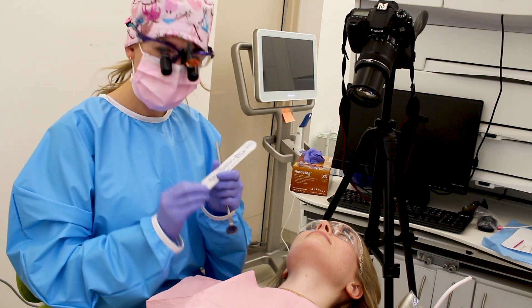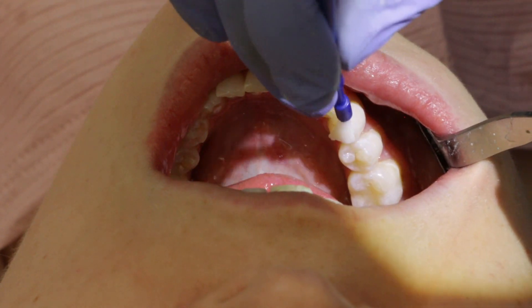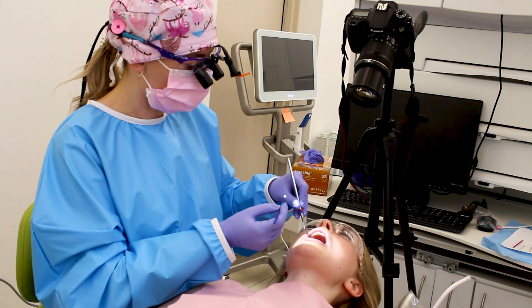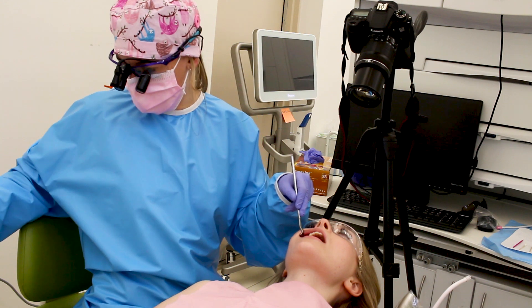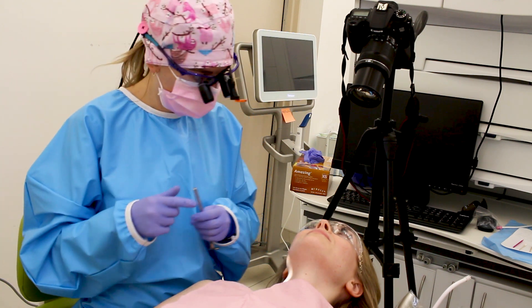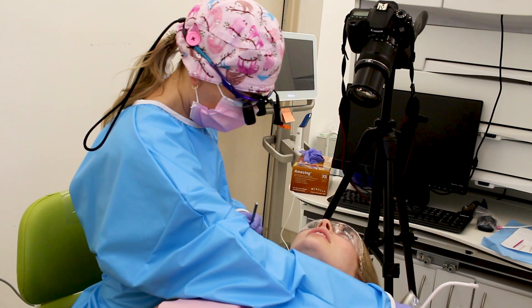We're going to open up the fluoride today and paint it on her teeth — it goes on almost like nail polish, you just paint it right onto the teeth, and because it's sticky it'll stick right where we want it. There's a whole controversy about fluoride and whether it's good for you, but for your teeth it helps to re-harden and re-strengthen the enamel, which prevents decay, cavities, acid erosion, and will just help to re-strengthen the teeth overall. That's it — that's the cleaning!